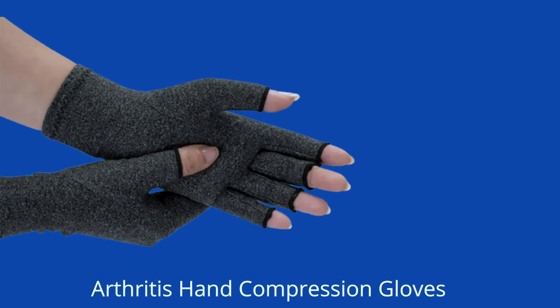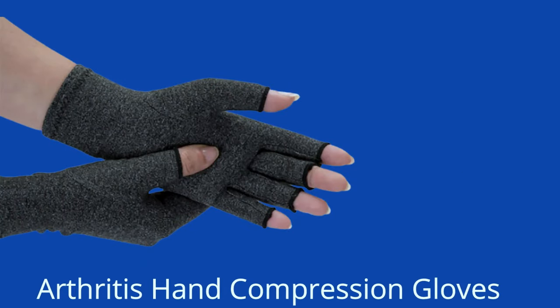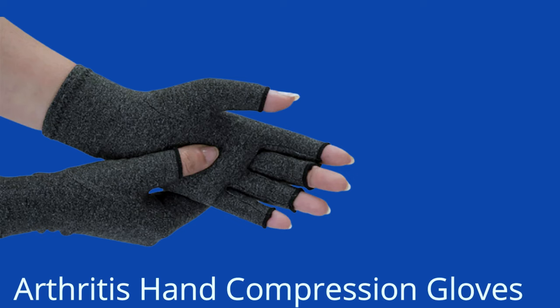Arthritis Hand Compression Gloves — when you have swelling in your hands, these compression gloves can be helpful. They provide gentle compression which can help reduce swelling and pain in your hands. They can also help improve circulation, which can help maintain hand flexibility. You should wear them at night and remove them during the day.